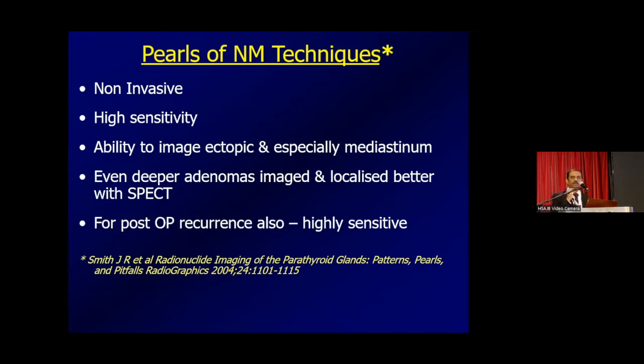So what are the advantages of a sestamibi scan? It is non-invasive. It has a higher sensitivity. You can image both the neck and the mediastinum, and for post-operative recurrence also it can be used. But when the deeper adenomas are there, or when it is in ectopic positions, especially in the tracheoesophageal groove or in the carotid sheath in the neck or behind the thymus, then you need more.